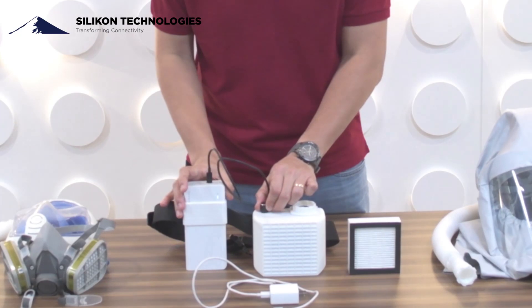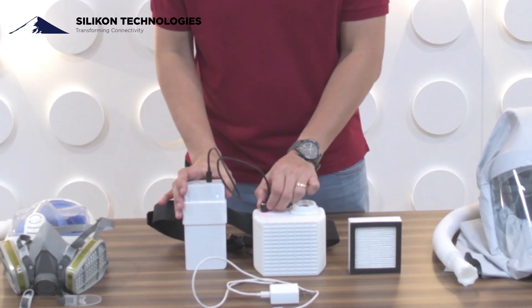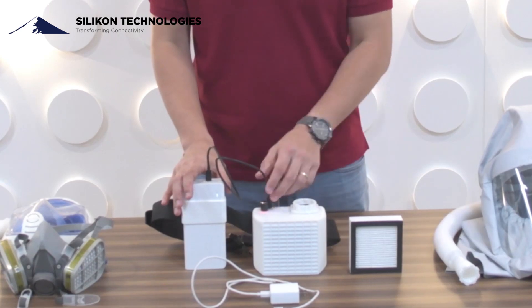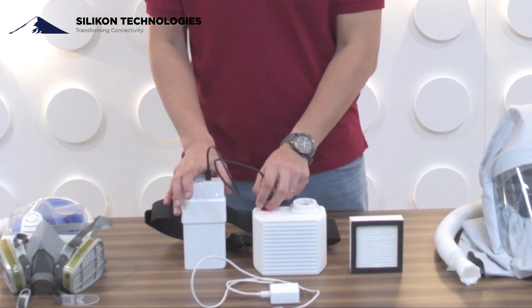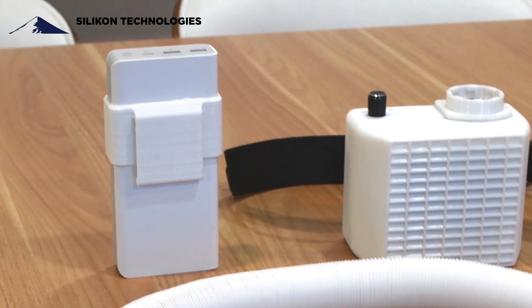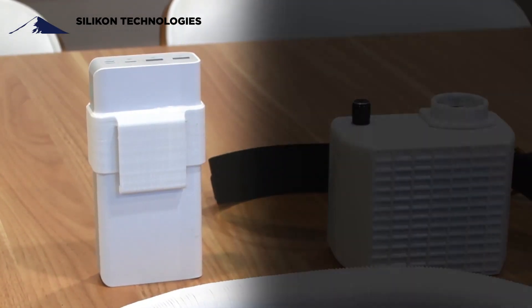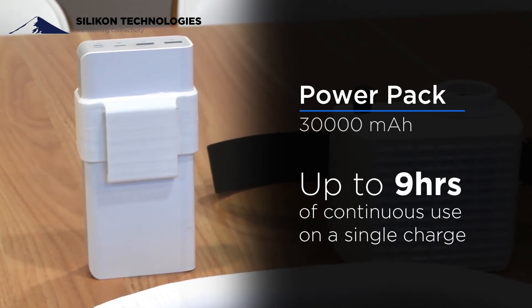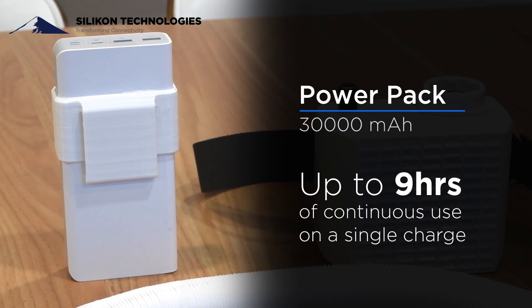So just to show you how it works — we turn on the power pack and then we have a variable airflow. The power pack is 30,000 milliamps and it can reach up to nine hours of continuous use on a single charge.